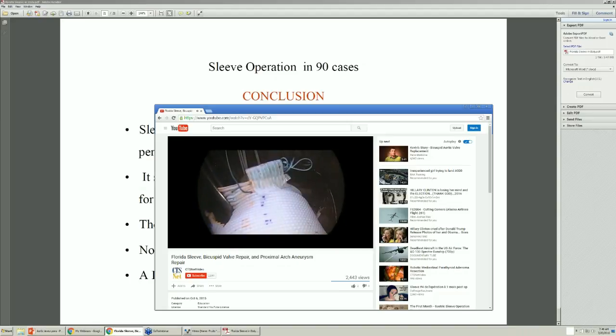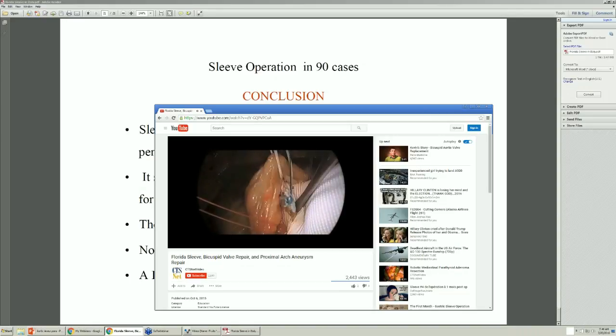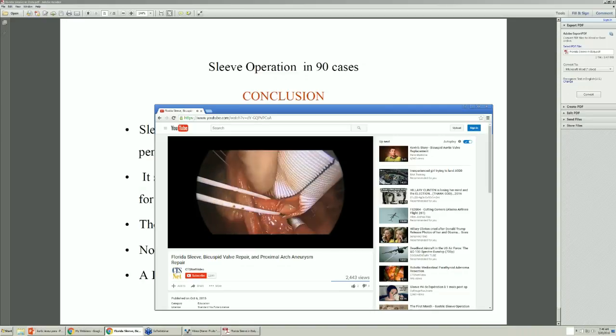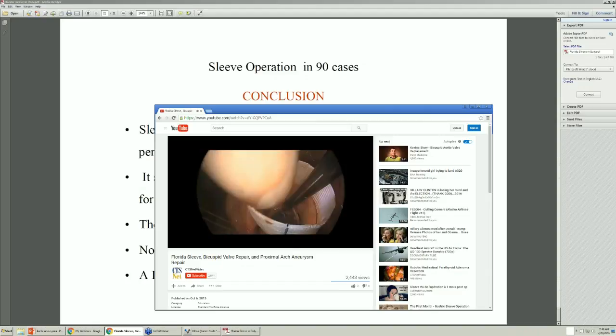There are slits that correspond to the area of the coronary arteries, and this graft can be made with these slits after this dissection has been completed, so they're placed correctly. Difficult to see here on the right coronary, but much easier here on the left coronary. You can see limbs of the slit which are being passed down to the left and right of the coronary origin itself, and these are anchored with the Ethibond sutures.